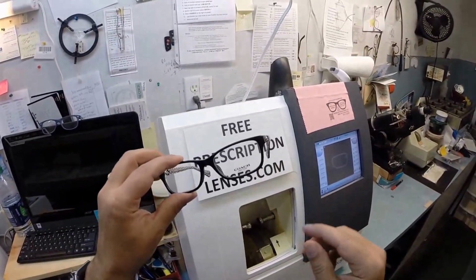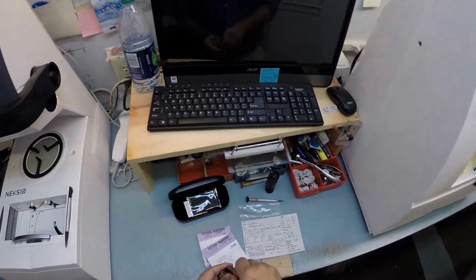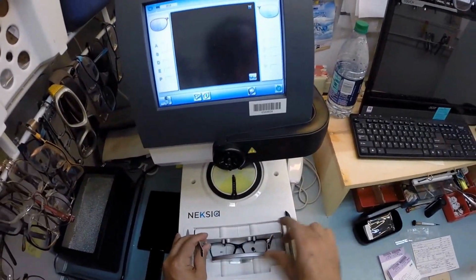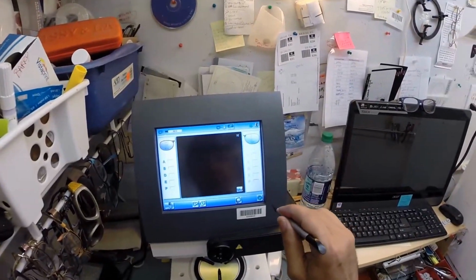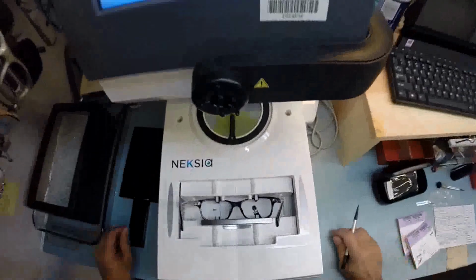I'm going to take out your original demo lenses, one of which says Coach. Pop those out real quick. And you will be receiving the original lenses, just so you know that they are authentic. But why wouldn't they be? But I'm going to take the frames, put them in the tracing element of my edger.